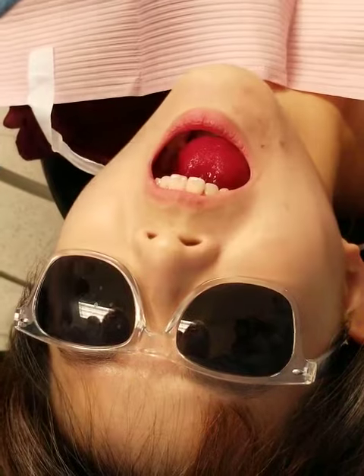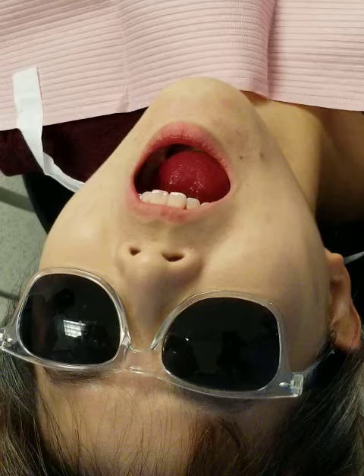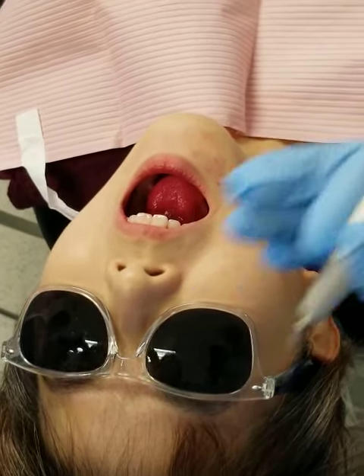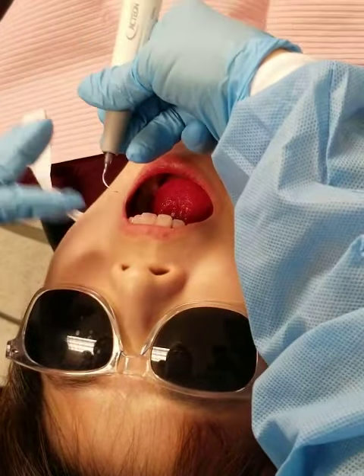Usually what I do is put the bigger drape on my patient when I'm using the piezo, and I have the patient hold the saliva ejector in their hand. About every two or three teeth, I take my piezo out and let the patient suck on it just like a straw. I hold this like it's a terminal shank.